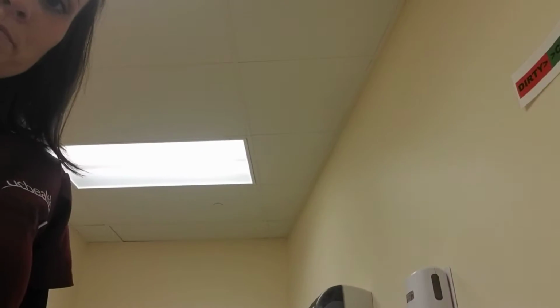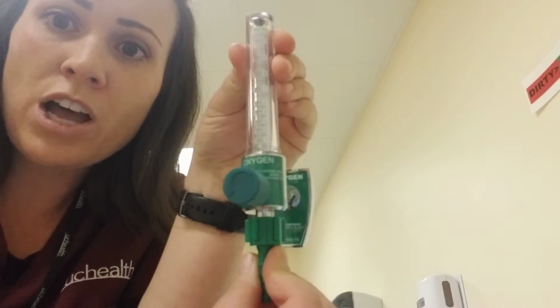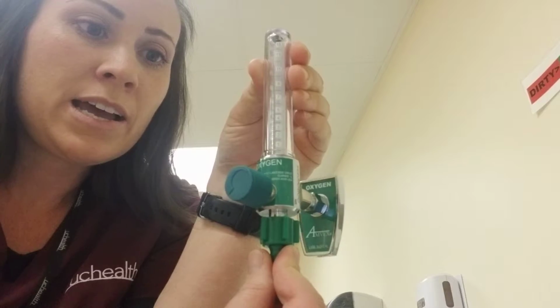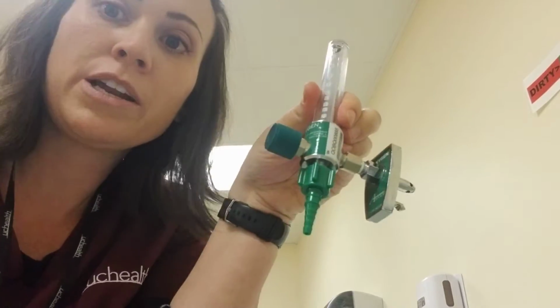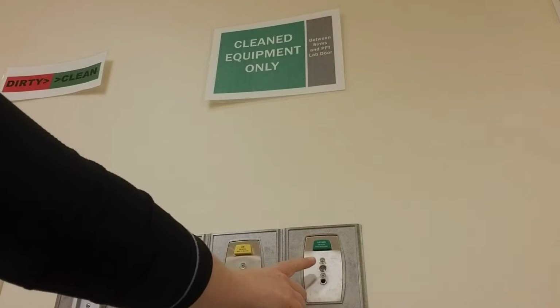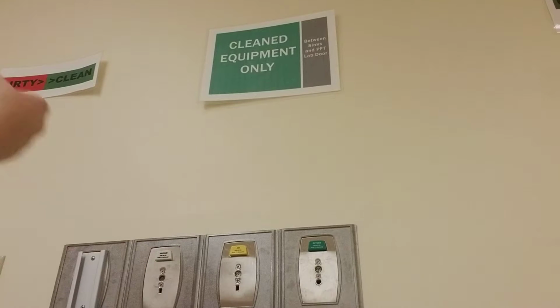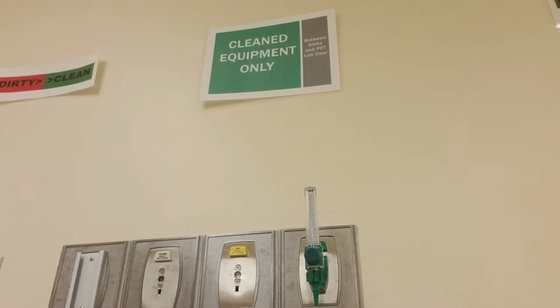Okay, I also want to show you here that we have a Thorpe tube. This is also color coded. It says oxygen on it, and it's a compensated Thorpe tube, and I'll show you how we know that. We're going to go ahead and hook it up to the wall unit here. You can see the wall also is color coded oxygen, air, and vacuum, green, yellow, and white. We'll go ahead and connect this Thorpe tube to the wall.